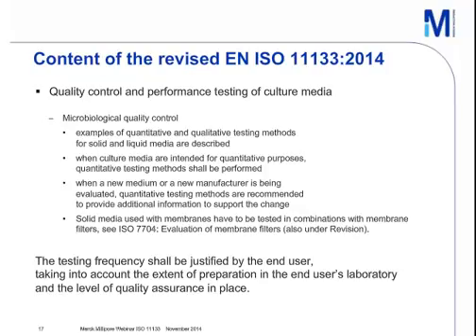For the microbiological quality control itself, examples are given in the standard of quantitative and qualitative testing methods for solid and liquid media. When culture media are intended for quantitative purposes, quantitative testing methods shall be performed. And this is very important and new in the standard. It was not mentioned so precisely in the technical specifications as here.